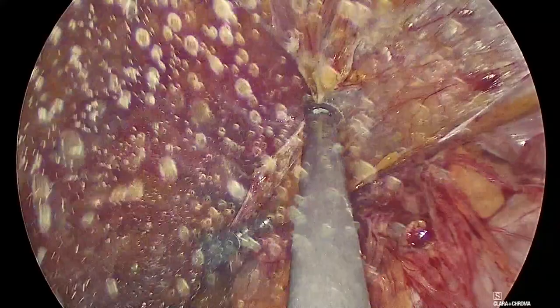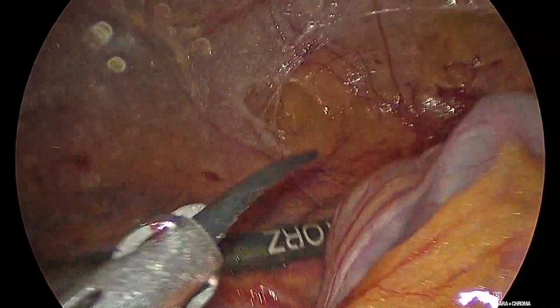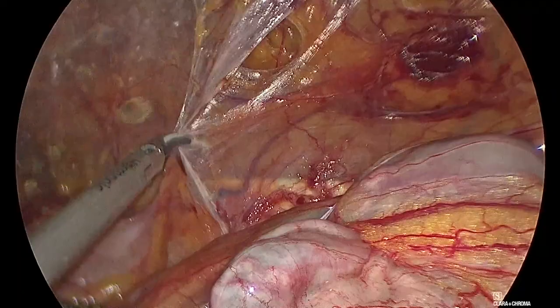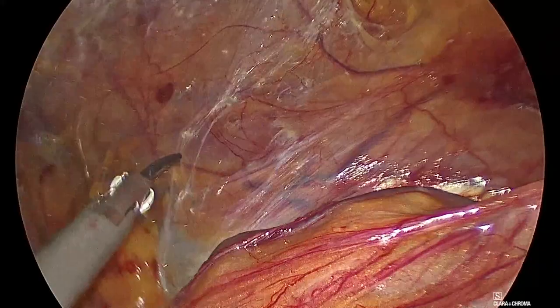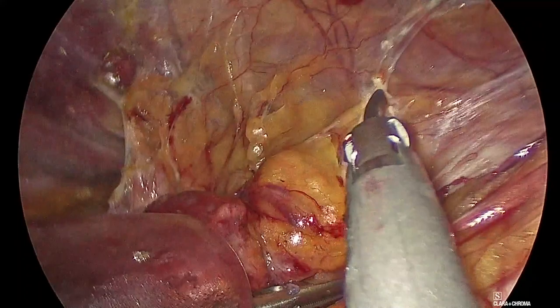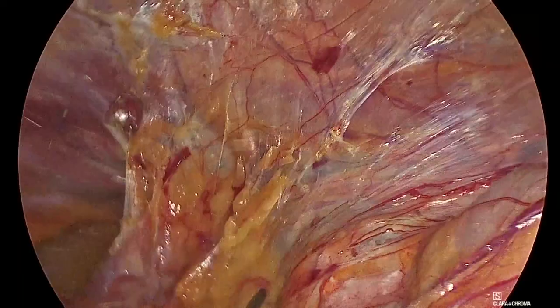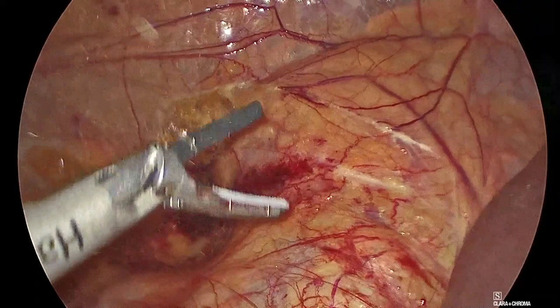So I'm just wondering, what's for you the advantage of the inline trocar positioning, like pararectally, instead of a more classical trocar setting? Well, if you look at the outside view, I am in a fantastic ergonomy. I don't have the camera in between my arms, and I can work absolutely free. It's a little bit different than the standard triangular fashion, where your assistant has his hand in between your hands. With this one, you don't. So ergonomically speaking, it's much, much better, at least for me. I was trained like this at UCLA, and I think it's absolutely my standard go-to. I teach my fellow this position, and at least for me, it works.